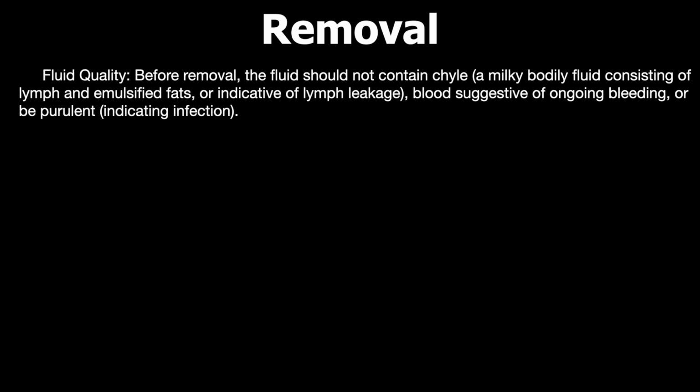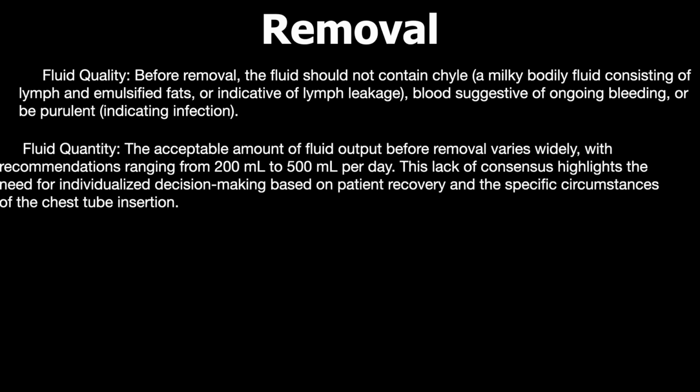Now, how to remove? Note the fluid quality. Before removal, the fluid should not contain chyle, that is the milky body fluid mixing the lymph and emulsified fat, indicating a lymph leakage, blood suggesting an ongoing bleed, or purulence. If any of this is present, then you should not remove the tube.